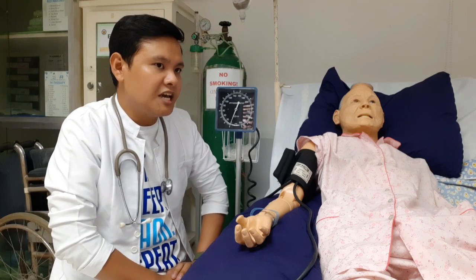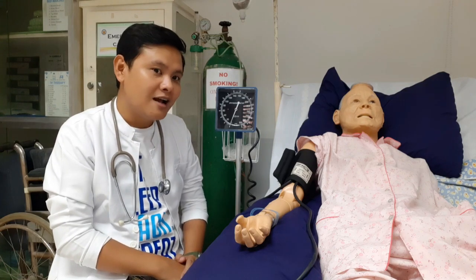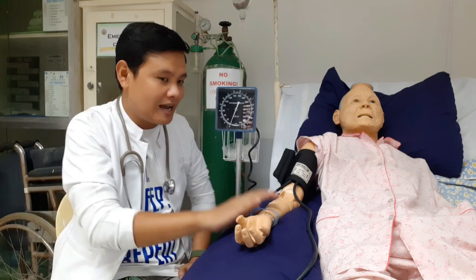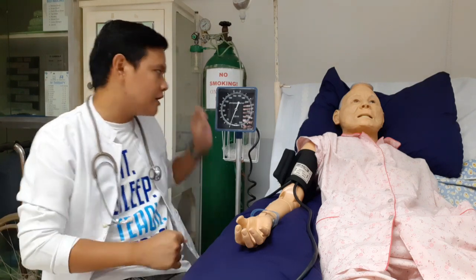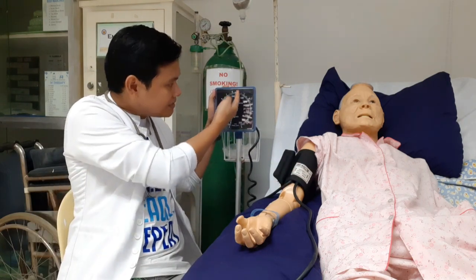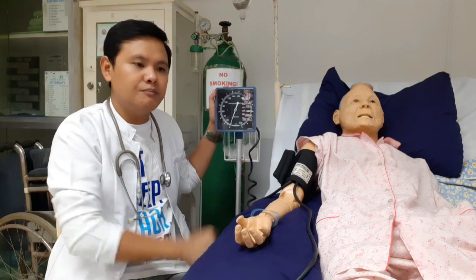Okay, so what else? If this is the first time that you're going to check for the BP of your client, you have to perform a preliminary palpatory determination of the systolic pressure. So sir, paano po ginagawa yun at bakit po natin ginagawa yun? Para malaman natin kung hanggang saan tayo mag-i-inflate ng BP cuff, and at the same time, alam natin hanggang saan dito sa sphygmomanometer natin tayo hihinto. Kasi if you will not do that, iba kung umabot ka rin ng 200, piga ka pa rin ng piga. Don't do that.